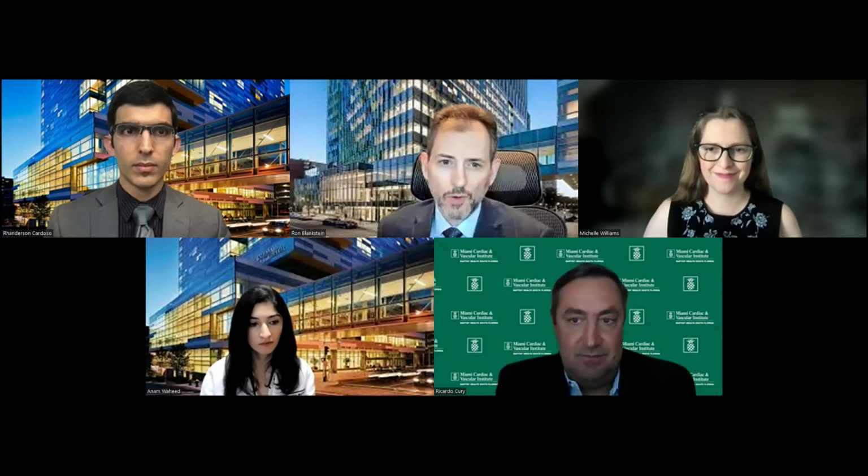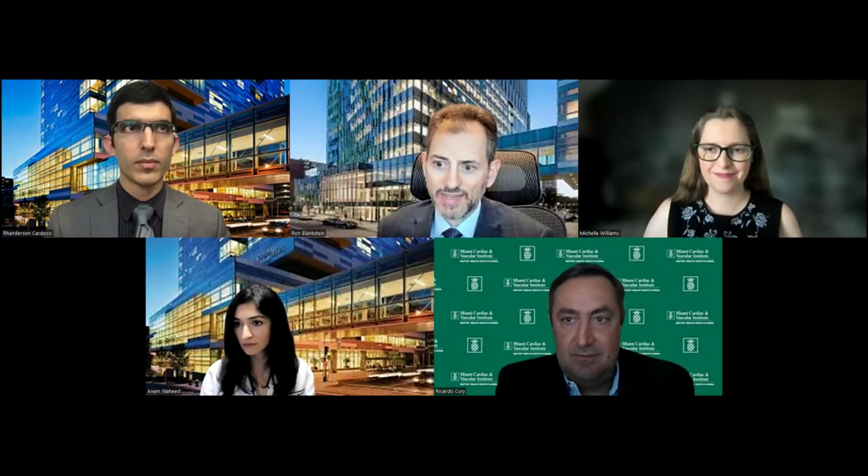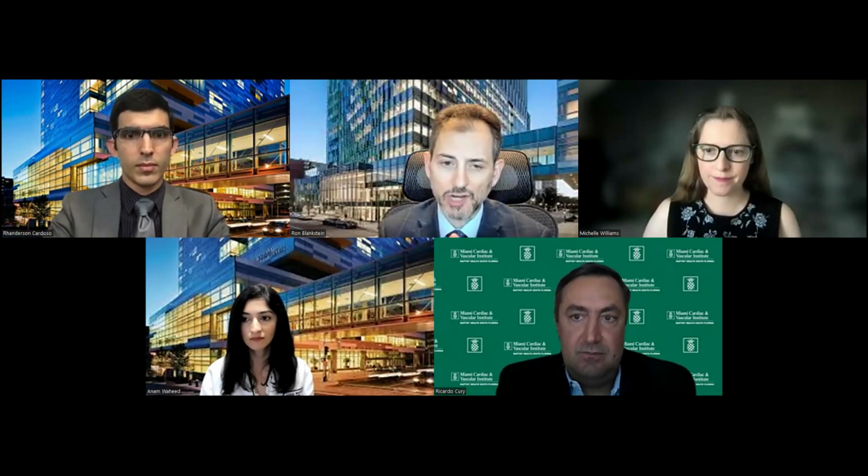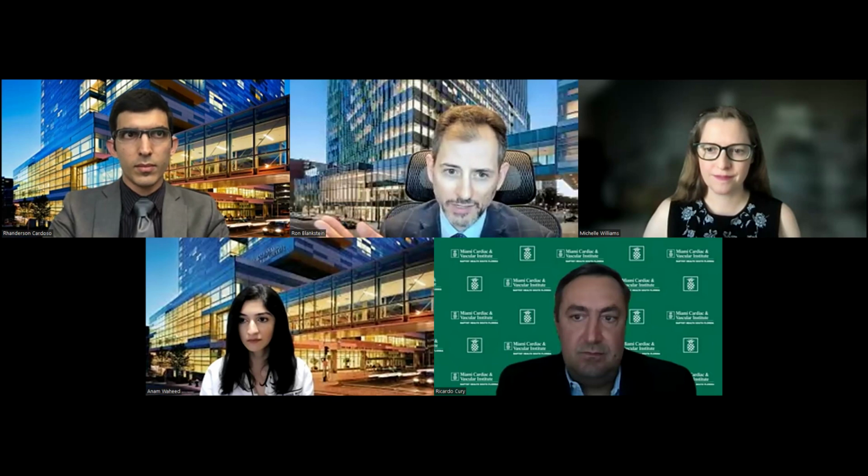Thank you. I'm just going to answer a question from the chat. It was actually about the AvoMD app, which you can download to your phone. One of the questions is that it gives an option to fill out stenosis in the P classification. But what about the other modifiers? And the answer is it's actually all in there. If you have a stent, if you have a bypass graft, if you have high risk plaque, that is all in that app as well. So just to answer that question.